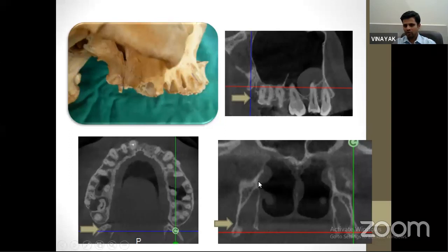Similarly, in this coronal section, we can see this medial pterygoid plate, and this is the lateral pterygoid plate. These are important while placing pterygoid implants, to know the anatomy and how to engage. So generally in pterygoid implants, what they do is they go from the 7 region, 1-7 or 2-7 region, from the buccal surface and go palatal, distal and apical this way.